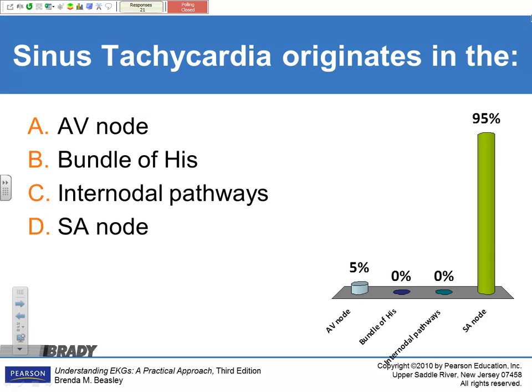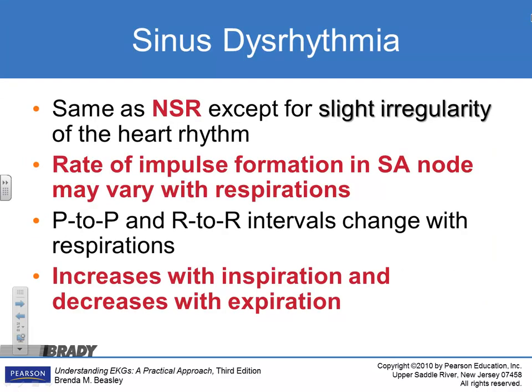Who put AV node? Somebody did. Make sure you look at your little thing, because sometimes I had a girl yesterday that had it upside down. That's correct. It's SA node, hence sinus tachycardia.